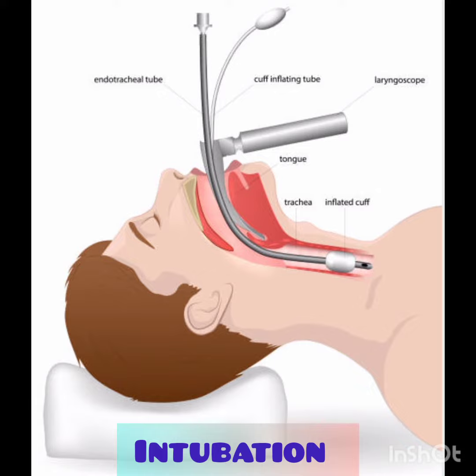If in the operating room, the doctor will typically sedate the person using an anesthetic, and will then insert an instrument called a laryngoscope into the person's mouth to aid placement of the flexible tubing. Then the laryngoscope is used to locate sensitive tissues like the vocal cords to avoid damage.